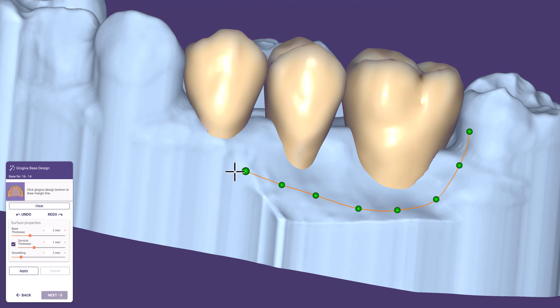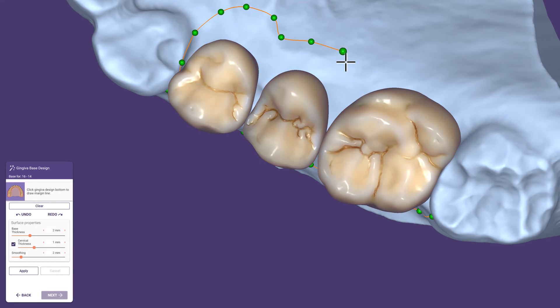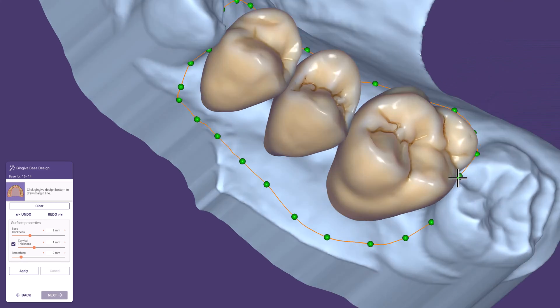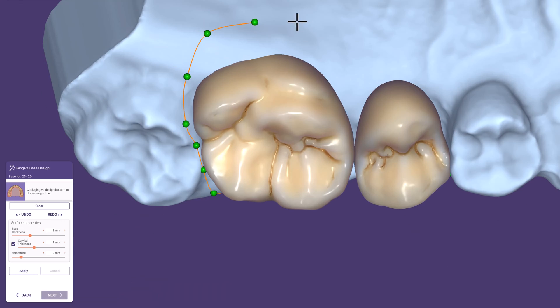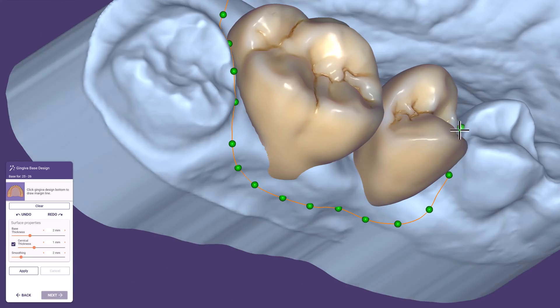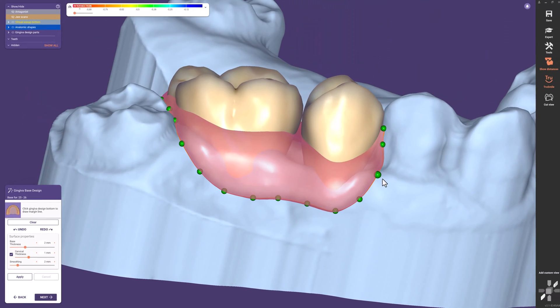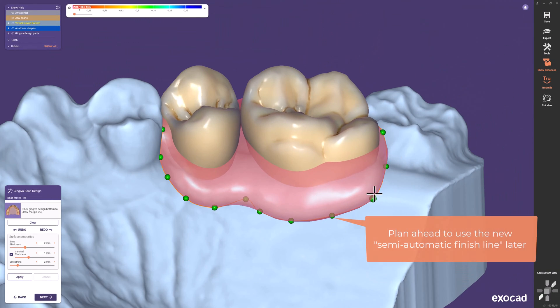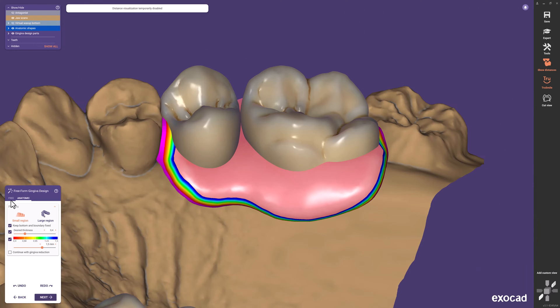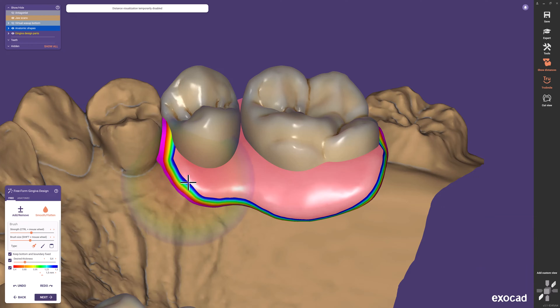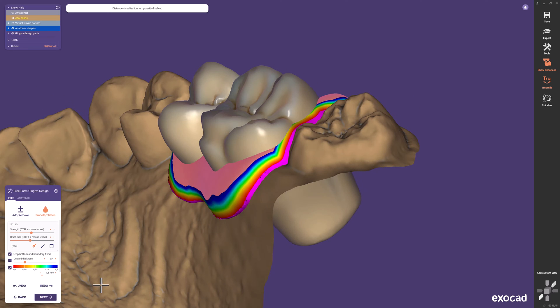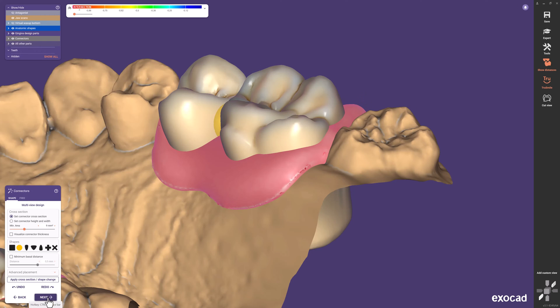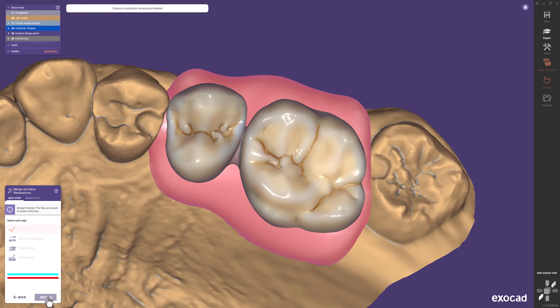When designing your gingiva, keep in mind that this will be the final design for your partial framework — the partial cut will use it exactly as designed here. With a double-click we finish the line drawing and make changes if necessary. If you want to use a semi-automatic finish line later, you can plan ahead by drawing the palatal area of your gingiva accordingly. In the free-form gingiva design step, use the smooth tool to flatten the palatal areas and achieve a smoother transition between the metal framework and acrylic gingiva parts. The design in the DentalCAD has now been finished.